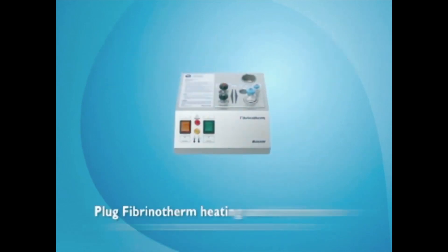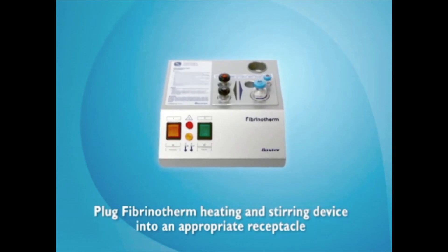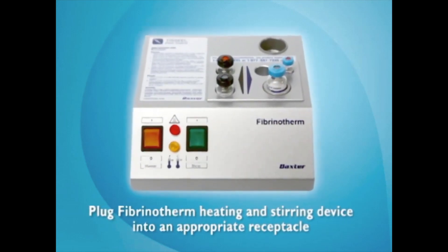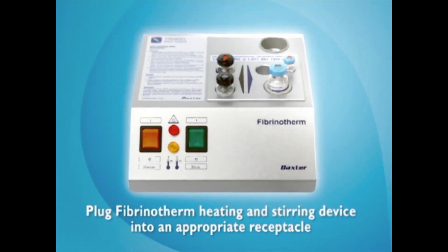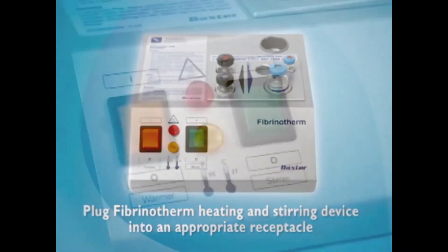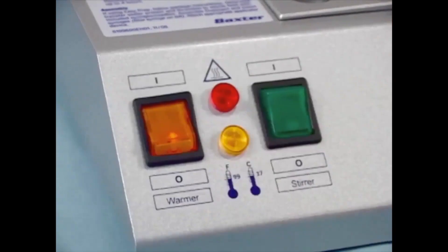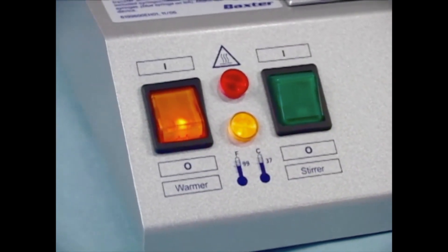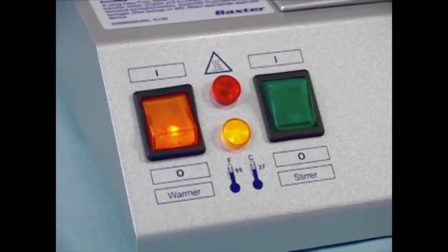The first step in preparing Tisseal Fibrin Sealant is to preheat the vials in the Fibrinotherm heating and stirring device. The circulating nurse will turn on the amber switch to activate the warming element. The indicator light on the Fibrinotherm will light, indicating the device is heating the vial. When the indicator light goes out, the operating temperature has been reached.